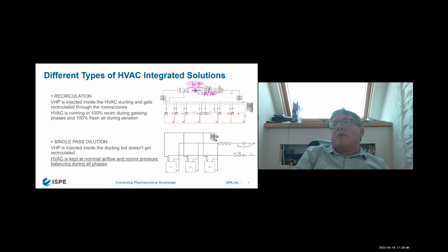Here at STERIS, we really try to take benefit of the HVAC and get the gas everywhere. So that's why we push this approach. For sure, we have the mobile equipment and plenty of different solutions, but here the goal was really to reach the maximum of surfaces equally, because at the end of the day, it's only a surface decontamination technology. It's not autoclaving. So to make sure the most surfaces are covered, we want to take the benefit of the HVAC.